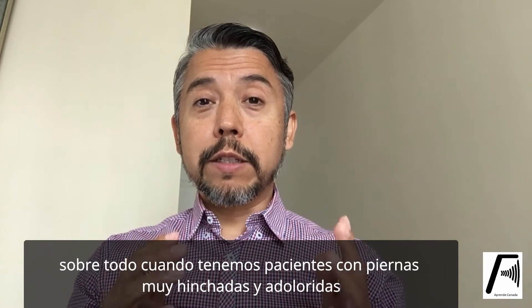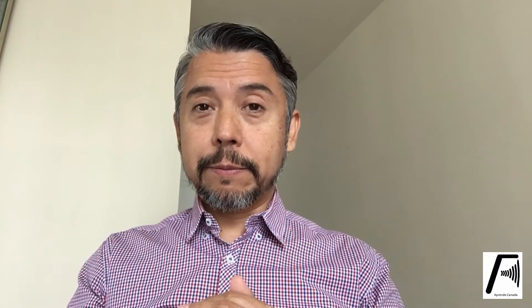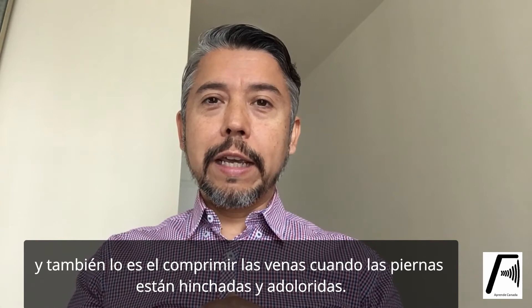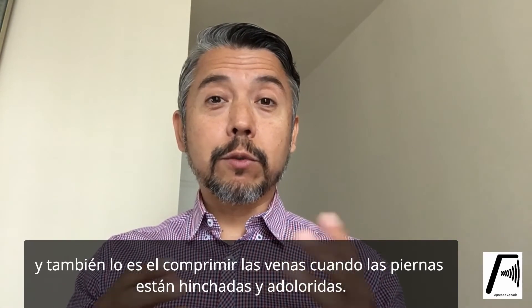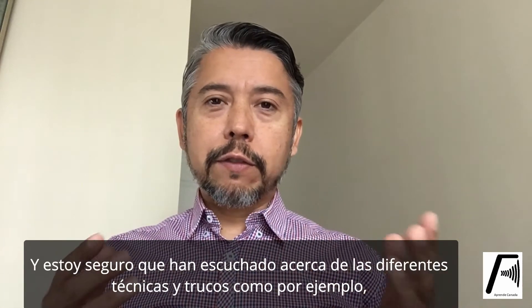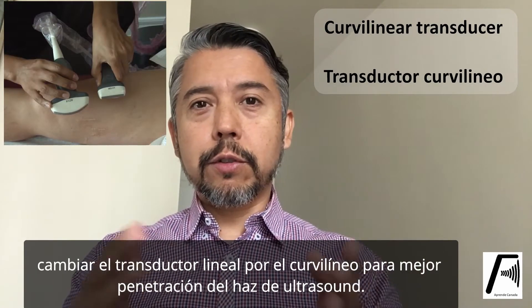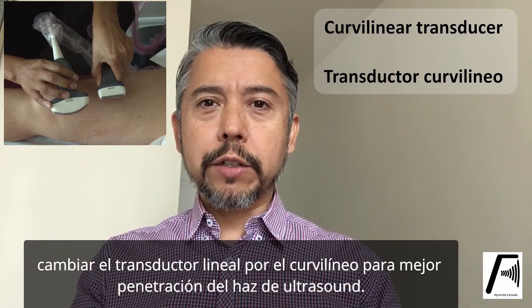Especially when we have to deal with patients that have very swollen and tender legs — the penetration is difficult, it is difficult to press on the leg. I'm sure that you have heard of different techniques and tricks, such as switching from the linear transducer to a curvilinear transducer for better penetration.